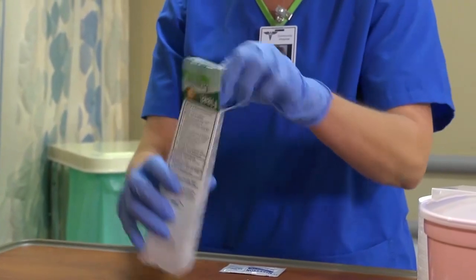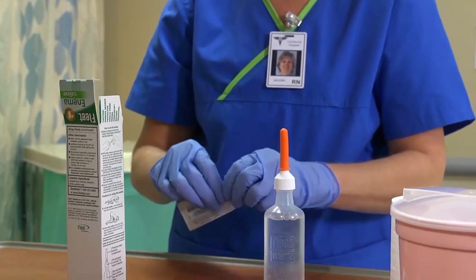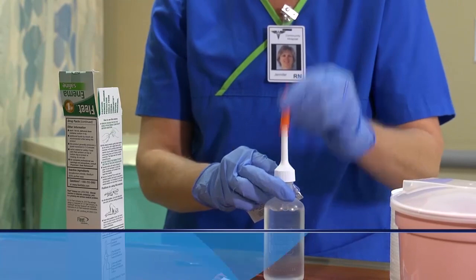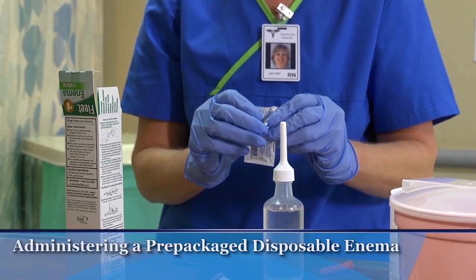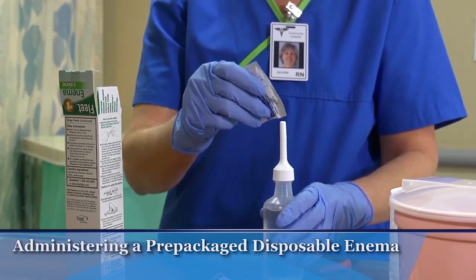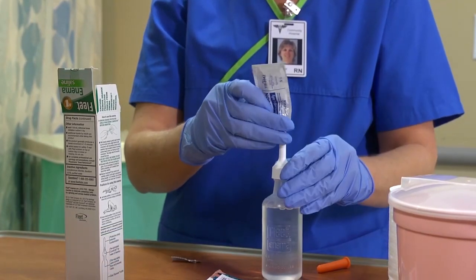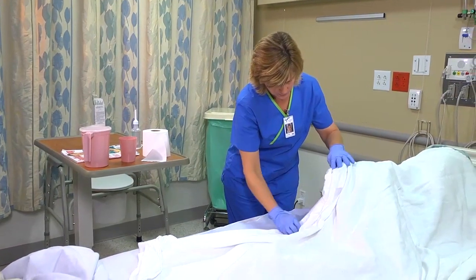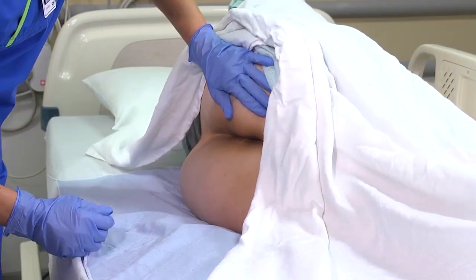If the patient will be using the toilet to expel the contents of the enema, make sure the bathroom remains unoccupied and keep the patient's slippers and robe handy. To administer a pre-packaged disposable enema, remove the plastic cap. If necessary, apply a little more water-soluble gel to the pre-lubricated tip. Ensure that there is a waterproof pad, absorbent side up, under the patient's hips and buttocks.